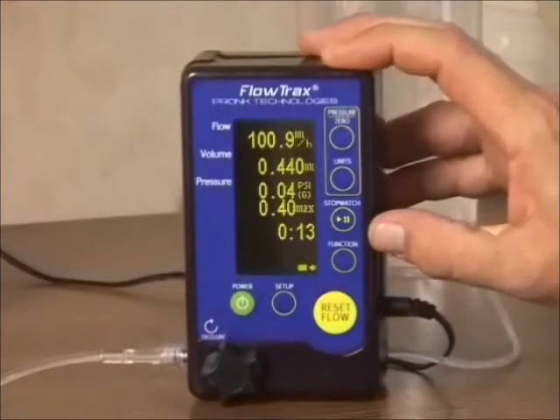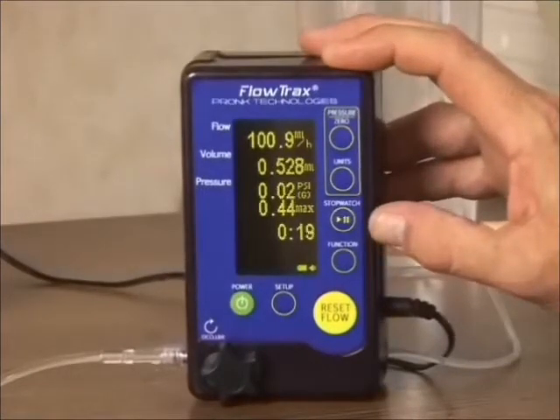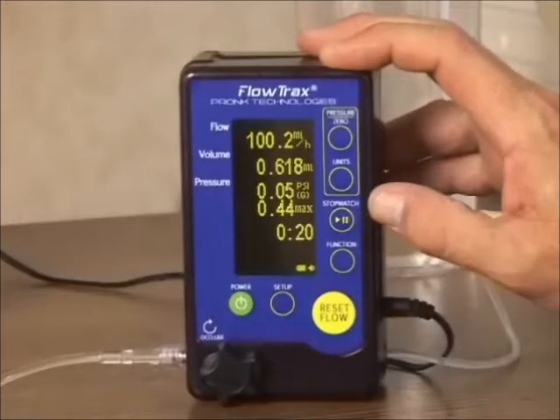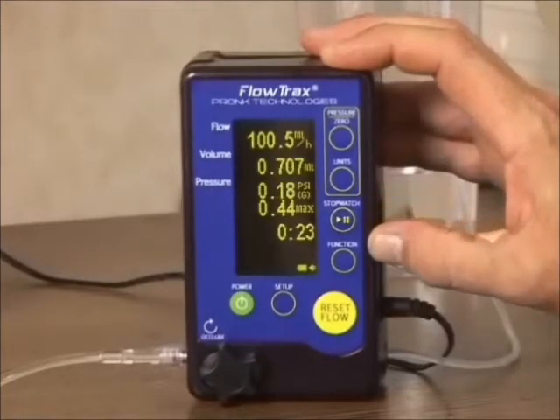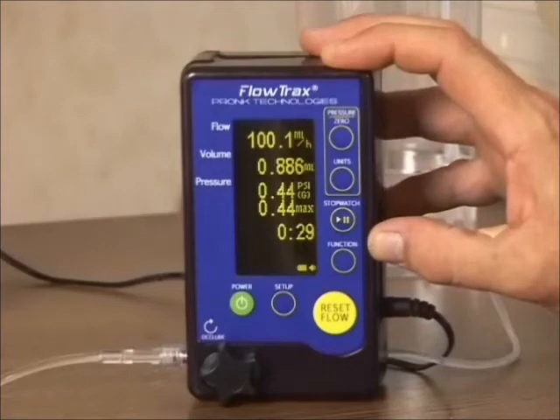The Flowtrax has an integrated pressure meter that provides for faster occlusion testing with great accuracy. The Flowtrax also has a digital stopwatch and timer, as well as external temperature measurement capability, all of which are NIST traceable.